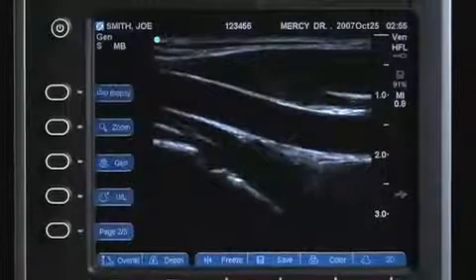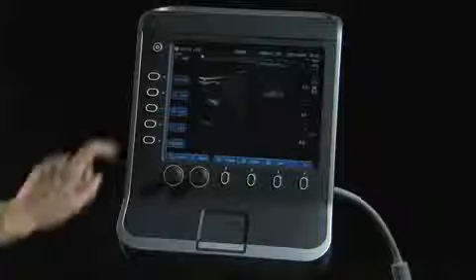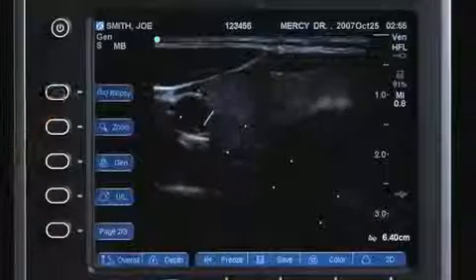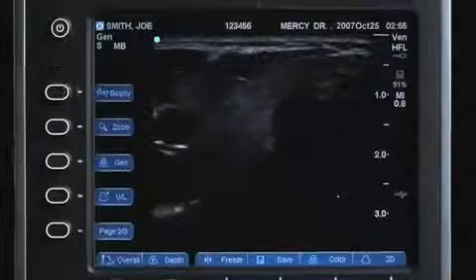The second page of the secondary controls includes the biopsy feature, which will depend upon the transducer type. Select Biopsy to display the biopsy guidelines. Select again to turn off.